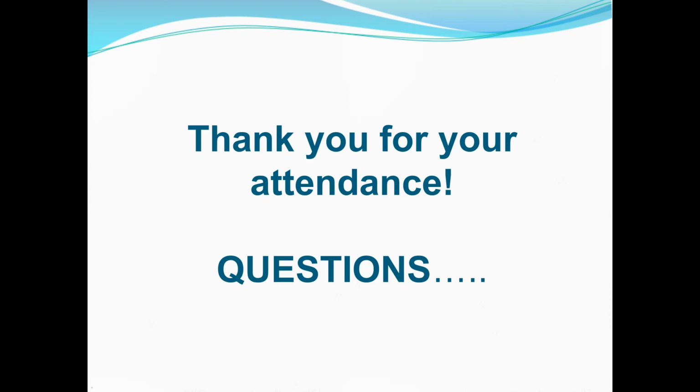Perfect. Next question. How good is this system at identifying fungal sepsis? We actually just got through validating that for fungal organisms. We are not using it for fungal sepsis. So like I said, if we do get a yeast, that goes straight to the molecular instrument, but we just validated our MALDI TOF for fungal elements in our mycology lab. Perfect, thank you.